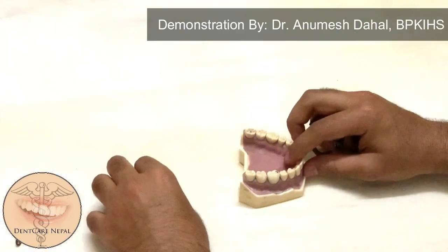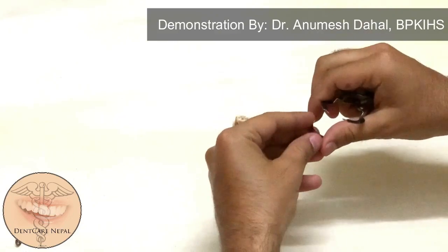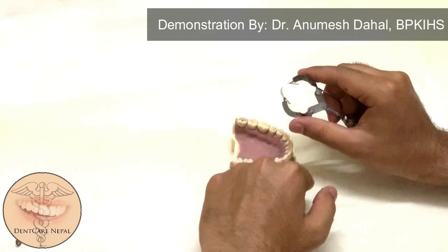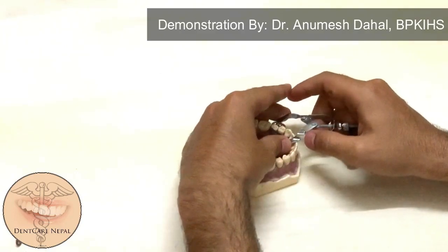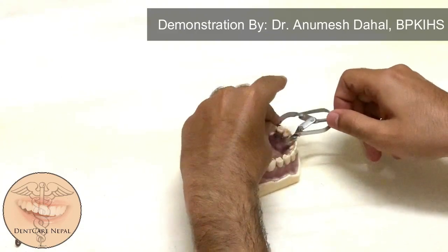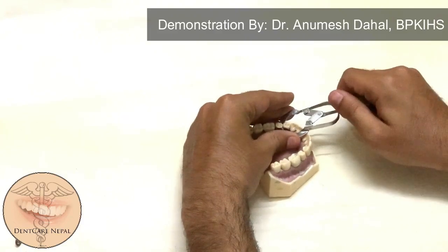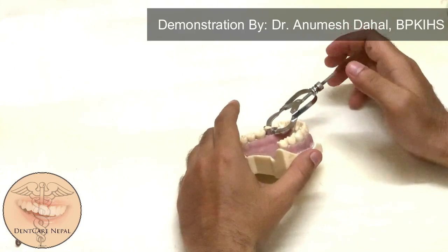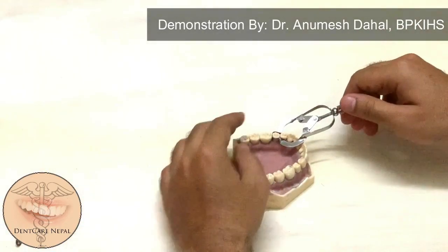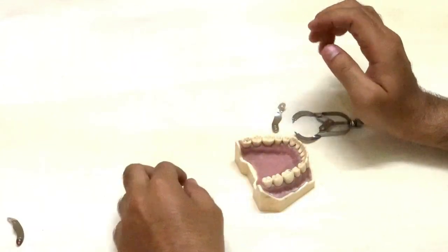Now let me show you the placement on the distal aspect. The placement of the band on the distal aspect should also make a complete circle around the tooth. As you can see, after this placement, you can tighten the matrix band. While removing, first remove the retainer and then the band, and the restoration is complete. Thank you.